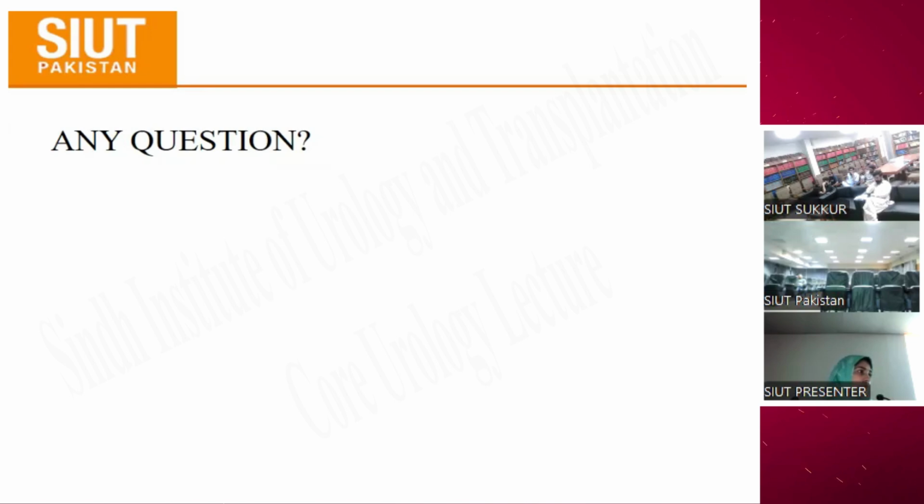So हर चीज को उसकी वैल्यू पे देखना चाहिए. सिस्टम चाहे इन्फेक्टेड हो चाहे नॉन इन्फेक्टेड हो, डीजे स्टेंट डालने से इन्फेक्शन ऐड नहीं हो रहा. डीजे स्टेंट इम्प्रॉपरली डालने से वो इन्फेक्शन ऐड हो सकता है. अगर पीसीएन भी आपने डाला किसी पेशेंट को, तो इसका ये मतलब नहीं है कि इन्फेक्शन ट्रीट हो गया, इसलिए कि पीसीएन इज अ ट्यूब विच इज ओपन टू एक्सटीरियर.